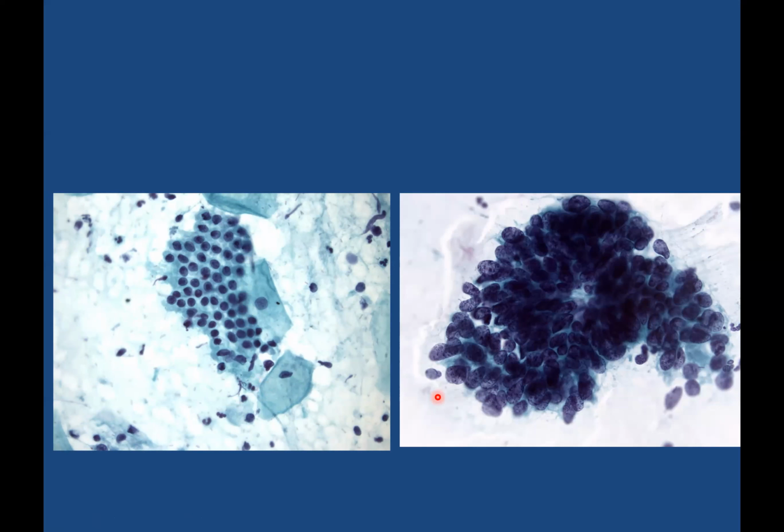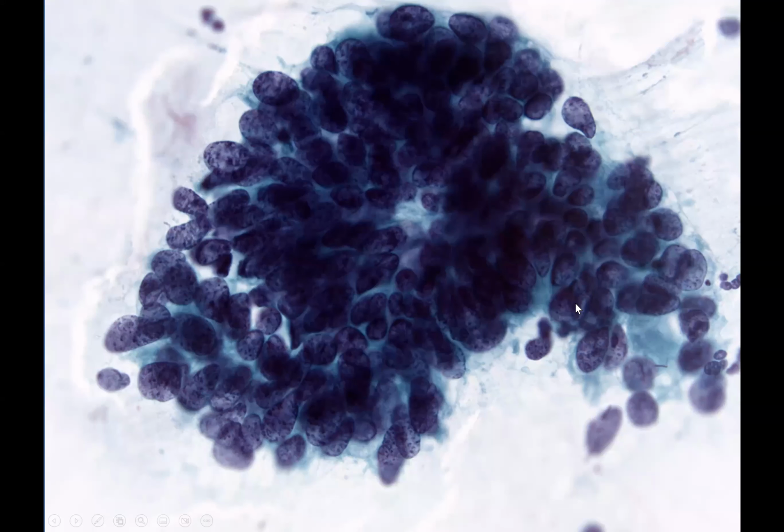And when we look at the nuclei in this instance, some of them look a little elongate, some of them are more stubby, but in fact the chromatin has this granular pattern to it, and you've got this depth of focus into a gland opening. This is on a higher power, and here I really want you to appreciate the chromatin. It has this very grainy appearance.